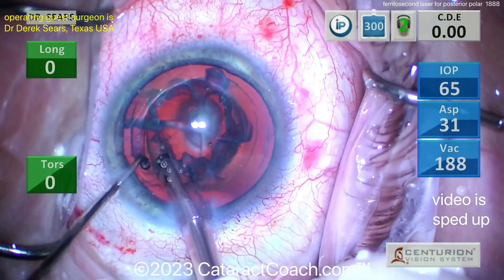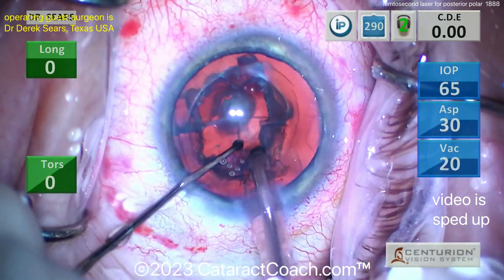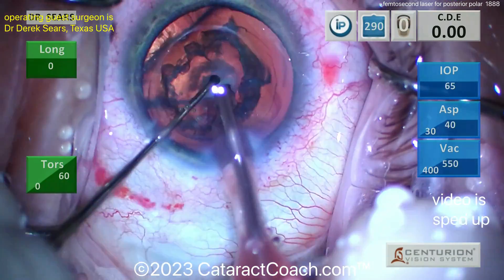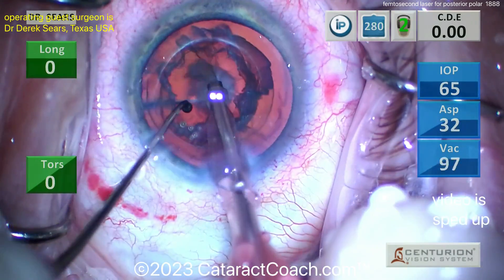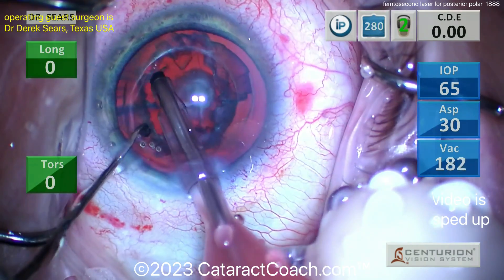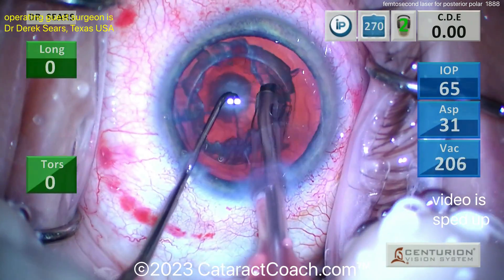Getting that endonucleus out — at this point you could probably just come out of the eye, because that epinuclear shell is so thick it's not going to let the bag collapse. But it's going to take the whole shell out. Using that chopper on one hand and the probe on the other — there was no hydrodissection, so maybe a little more challenge to remove this.